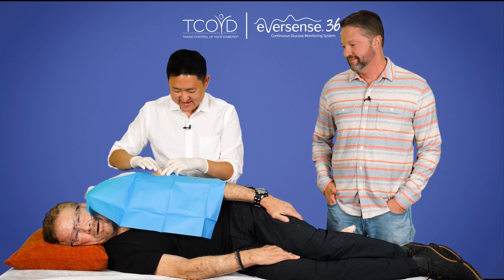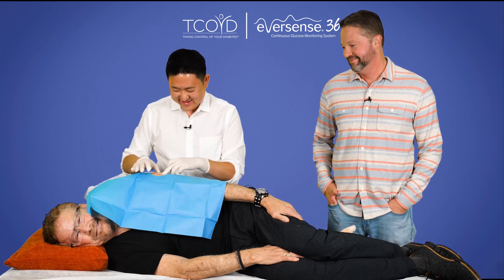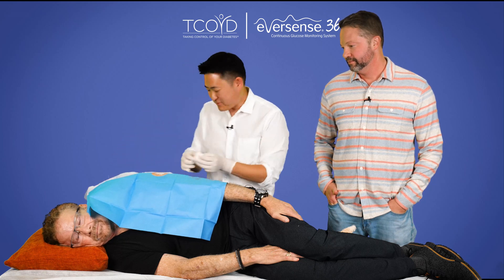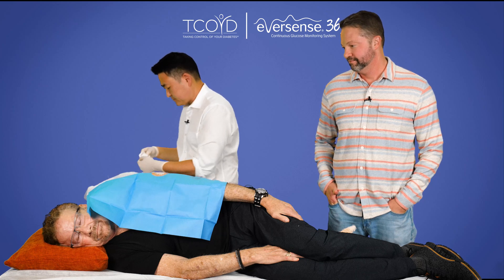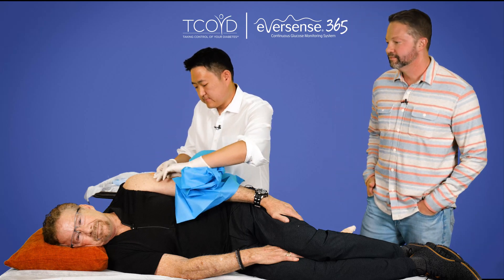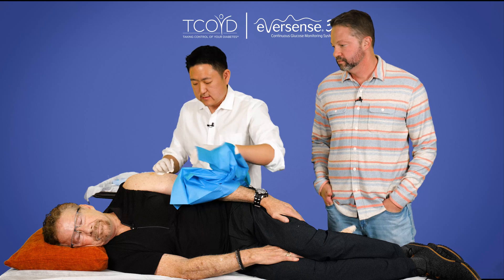Nothing worse than my ex-wife taking out my stitches. A little tic-tac-toe game. Different people have different SteriStrips application tactics. And then this is the Tegaderm patch we're going to put over it. We'll take this part off. And that's about it.